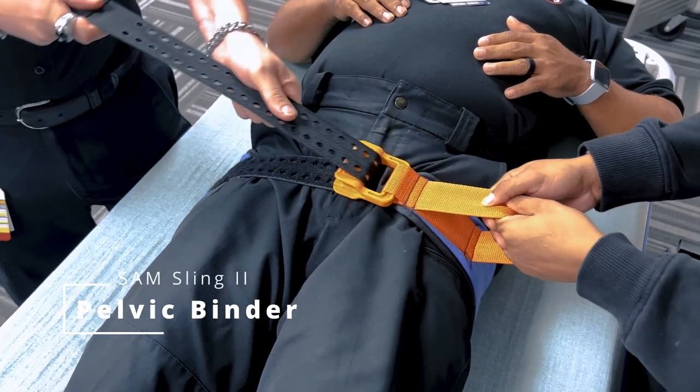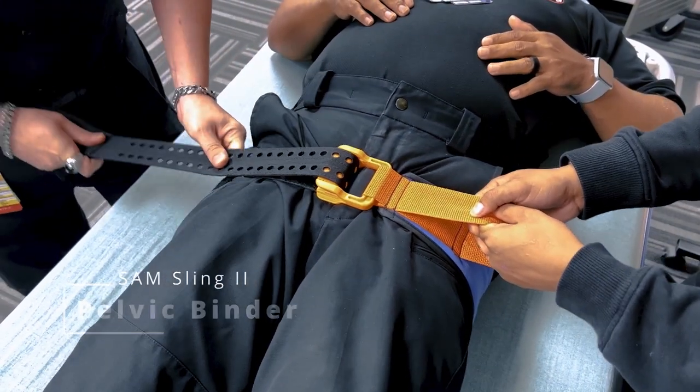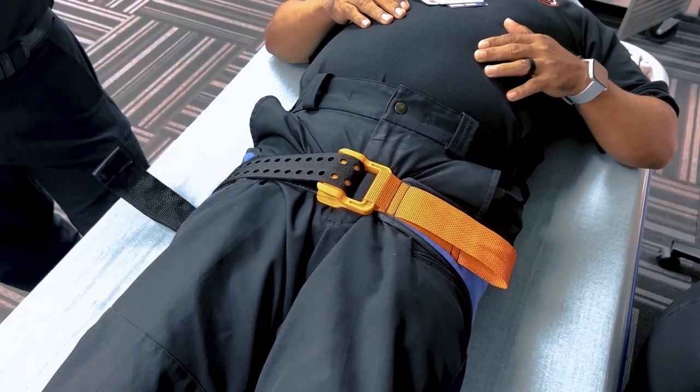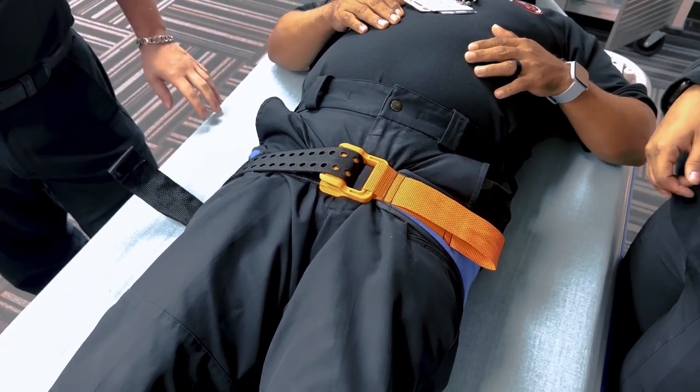Welcome to this demonstration on how to properly apply a pelvic binder. In this video, we'll go through the steps for applying a pelvic binder to stabilize pelvic fractures and reduce bleeding. Let's get started.